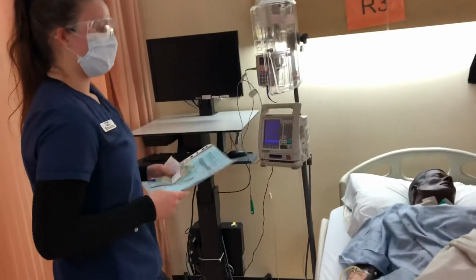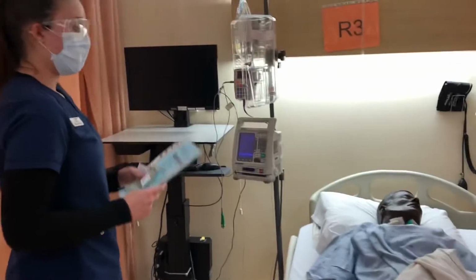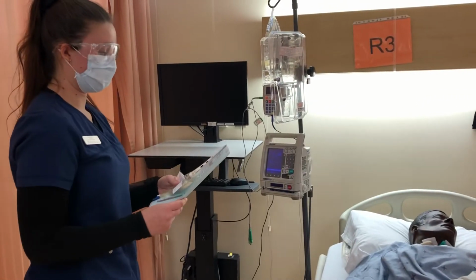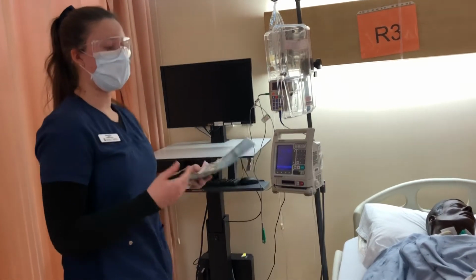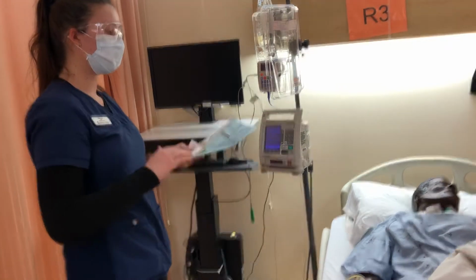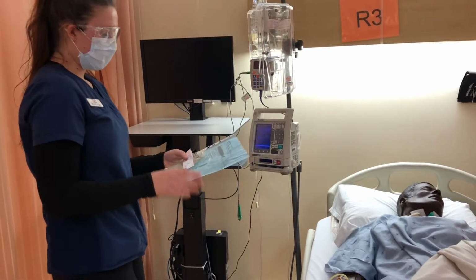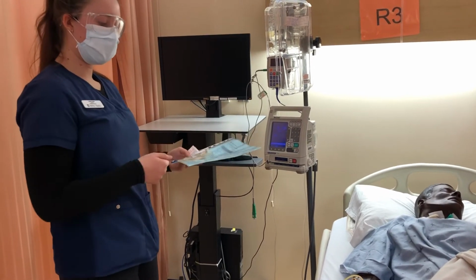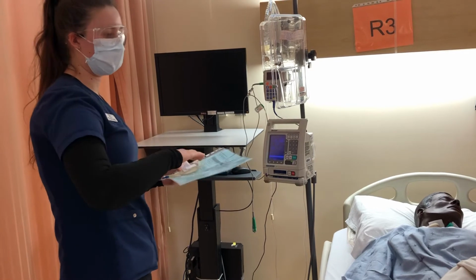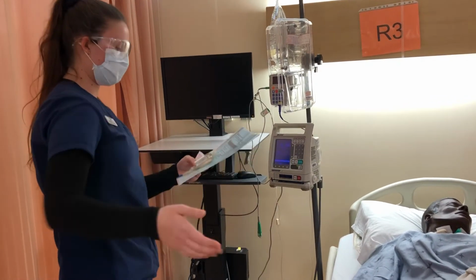That all checks out, so I'll tell my patient what I'm here to do today. I'm here to change the bag for your PCA morphine. Morphine is a medication to help with your pain relief. I have checked your baseline vitals, respiratory, and mental status because some of the hazards of the medication is that it may slow down your breathing, make you nauseous or confused, so you can keep an eye out for those symptoms. PCA works where you can press the button every 5 minutes to receive a dose. If you don't press the button, you won't receive a dose, but if you press it before, you won't receive a dose because we don't want you to get too much medication. So 5 minutes is your interval here.